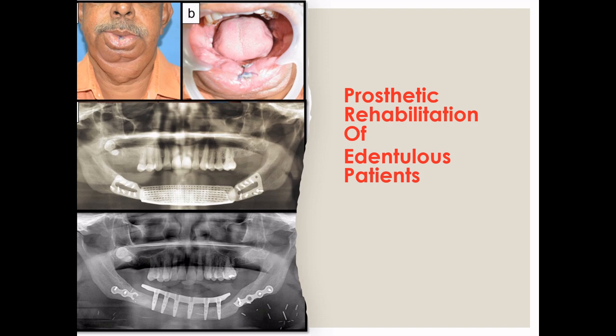And in such cases, only with implant retained and supported overlay dentures will the patient have the opportunity for efficient mastication. Recently, the use of advanced 3D imaging and the introduction of CAD/CAM have led to successful rehabilitation of such patients to a near normal function and aesthetics.